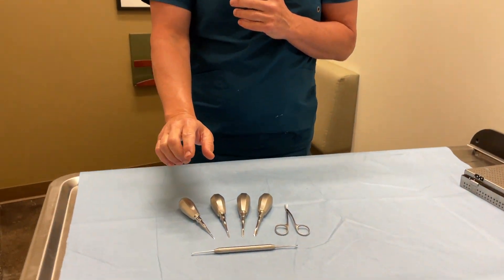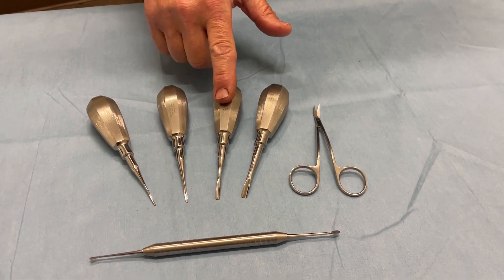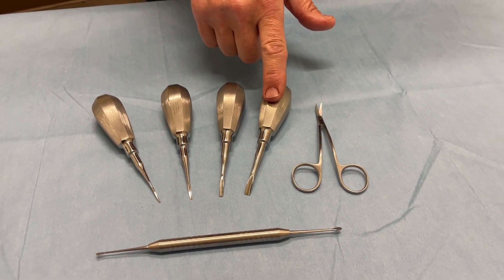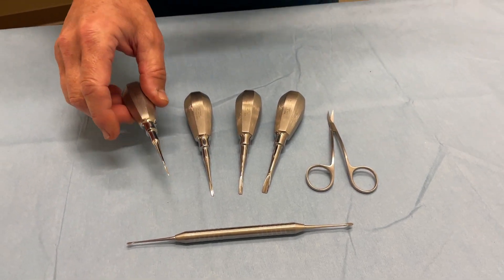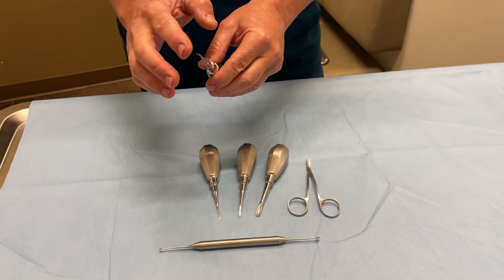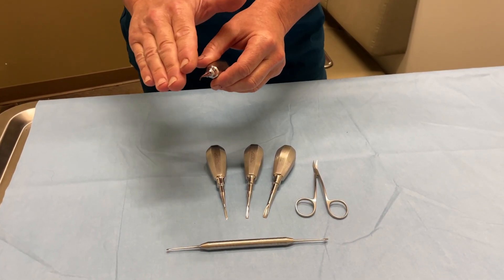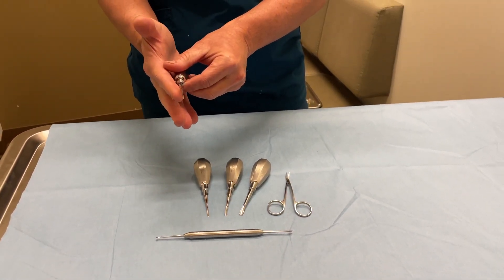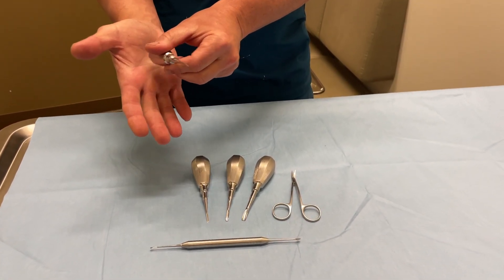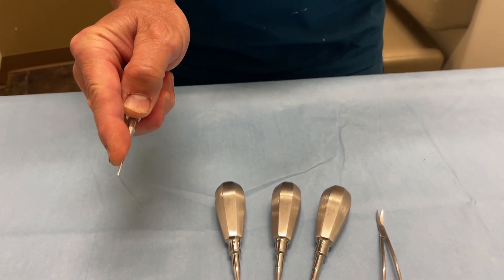So in this kit, we have four elevators: a one-millimeter elevator, a two-millimeter elevator, a three-millimeter elevator, and a four-millimeter elevator. These are really nice and short-shanked, and what I really like about them — other than being really sharp — is that angulation there to get into the periodontal ligament space and luxate the tooth out. That's why they're called luxating elevators. They're short-shanked, so you can seat it well into your palm and still be able to put your finger down at the tip.